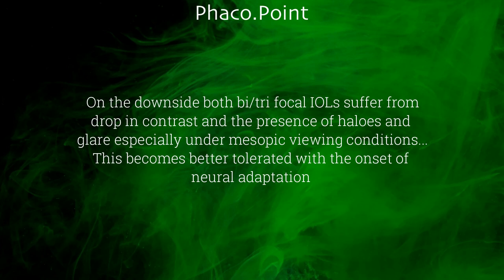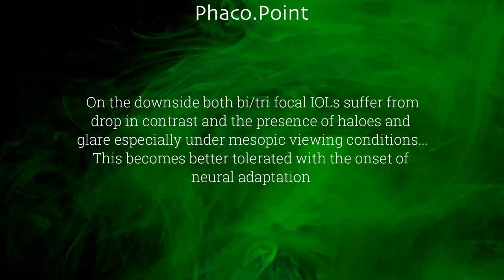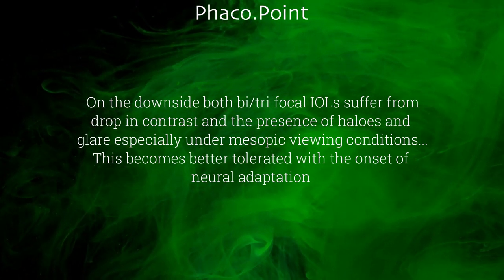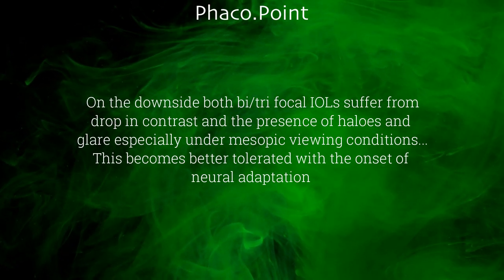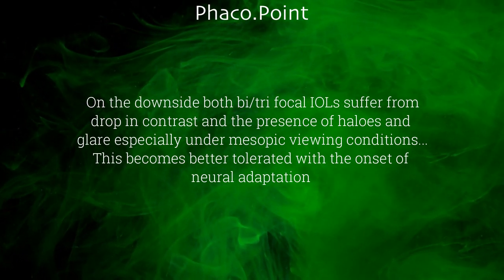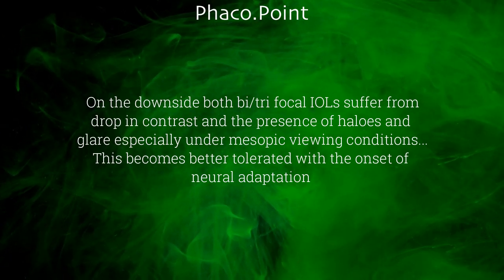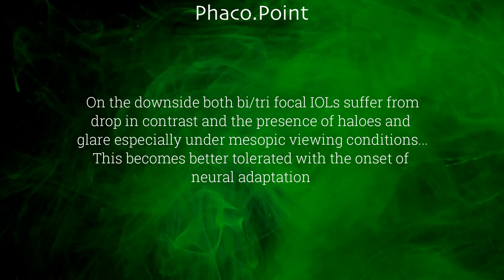However, the trade-off of using bifocal or trifocal diffractive design multifocal lenses is that there would definitely be a drop in contrast because of the split of the light energy distribution for the distance and near focus, and 20% of light being lost. In addition, the patient will appreciate halos and glare because of the blur circles and the need for physiological suppression that occurs. But with the onset of neural adaptation, this becomes progressively lesser as time goes on.